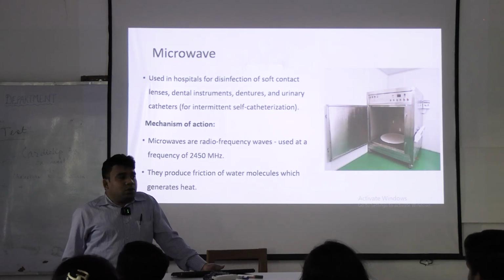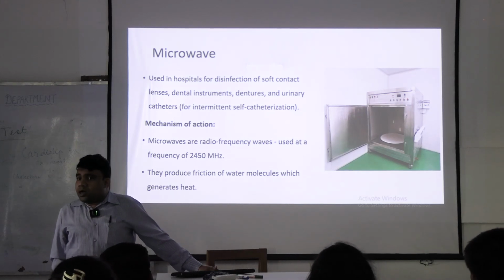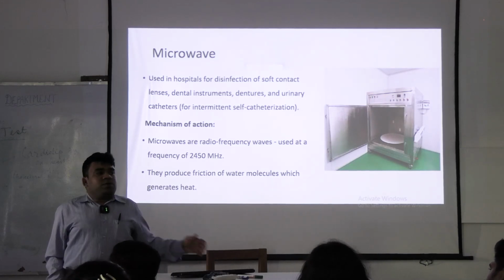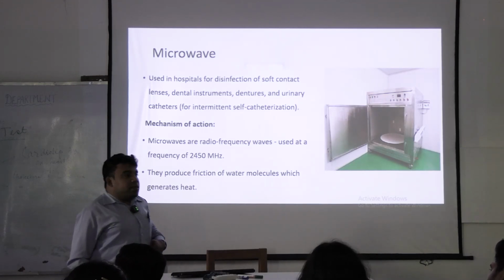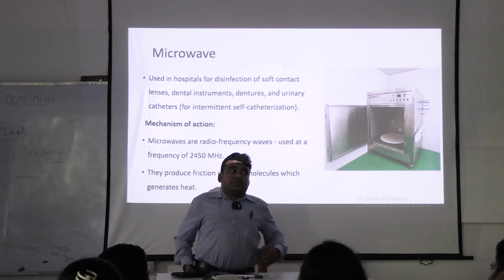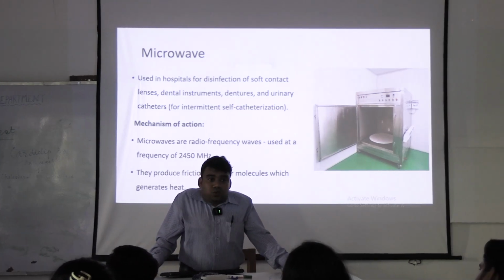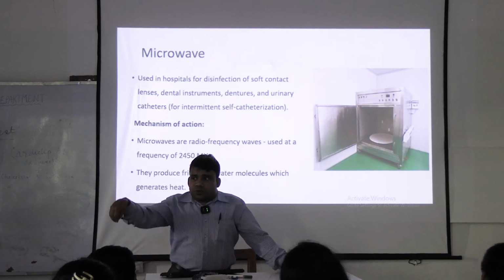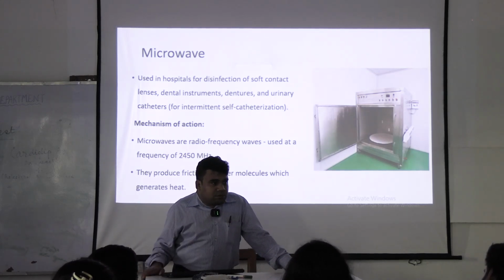Okay. And the second question, that was spreading of infection because of the laparoscope that was used. What do we need to do? First, we need to understand what type of instrument this is. A laparoscope enters into the abdominal cavity, that's a sterile area. So, is it critical, semi-critical or non-critical? It's critical. So, what do we need to do? Now, laparoscope is a sophisticated instrument. You cannot put the laparoscope in an autoclave and run the autoclave.